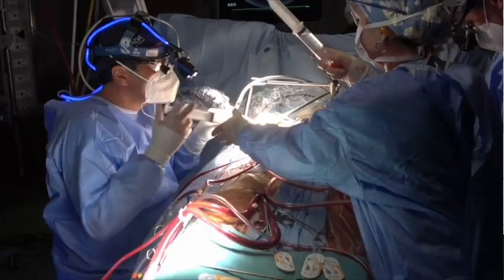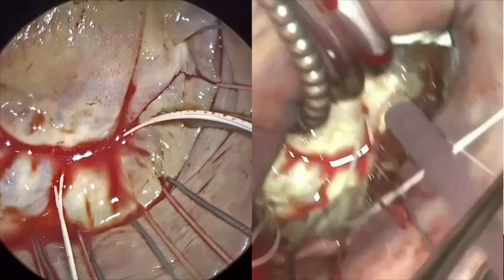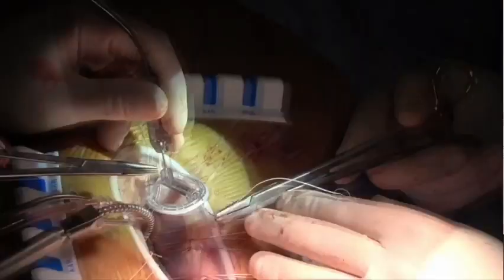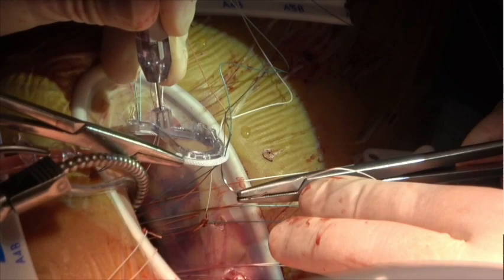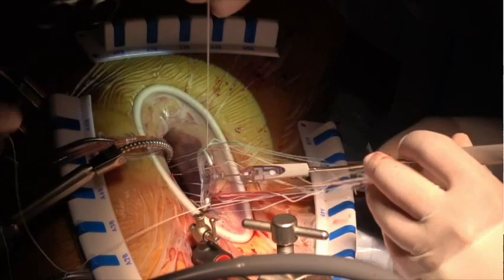Water test. The valve looks pretty fine. We size the ring — sizing is based on the surface of the anterior leaflet. This is the ring; we are passing sutures through it. The chords are passed through the ring and we set it down, tied with a core knot.